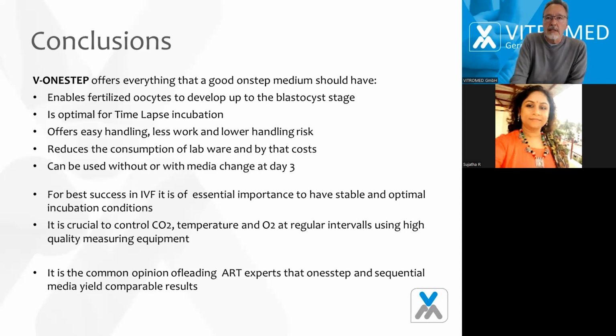For best success in IVF, it is of essential importance to have stable and optimal incubation conditions. It is crucial to control CO2, temperature, and O2 at regular intervals using high quality measuring equipment. So this is really very important. You have to do this. It is the common opinion of leading ART experts that one-step and sequential media yield comparable results.